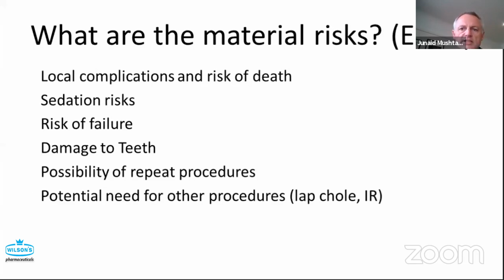So what are the material risks in ERCP? Well, there are the local complications that we all know about in terms of perforation, sepsis, hemorrhage, and pancreatitis. And of those, I often say to patients that the ones that we are really worried about are perforation and pancreatitis.